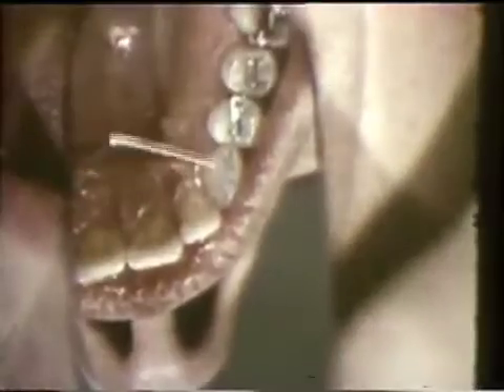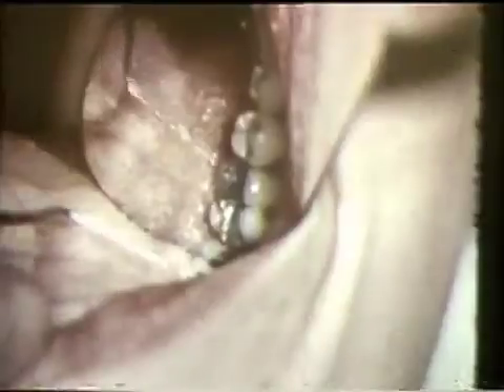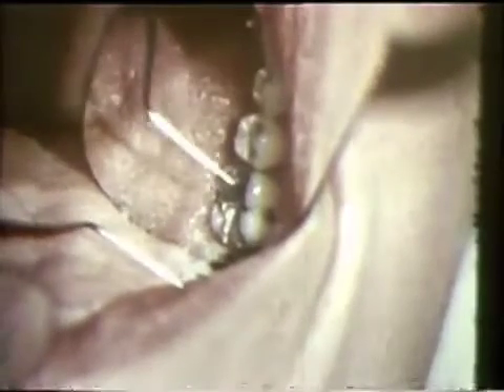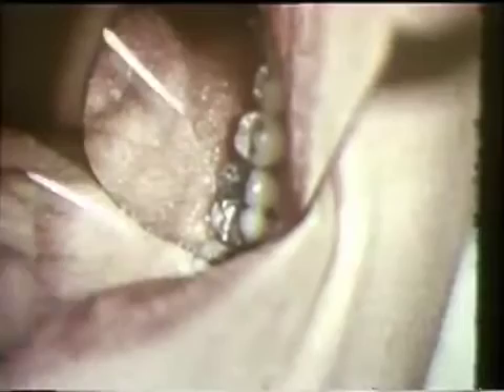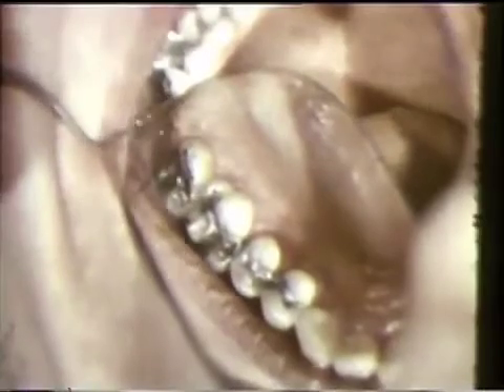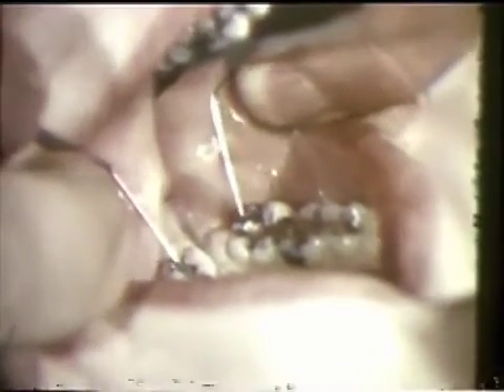The contacts are recorded with carbon paper. Rubbing contact is seen on the left cuspid and the distolingual cusp of the mandibular first molar. On the balancing side, there are contacts on the buccal incline of the lingual cusp of the maxillary right second molar against the lingual incline of the distobuccal cusp of the mandibular second molar.